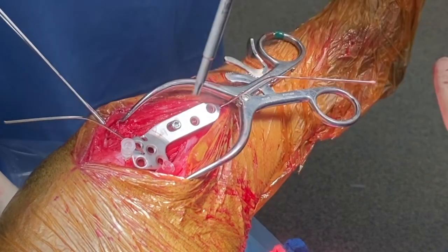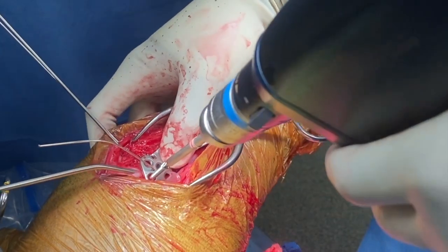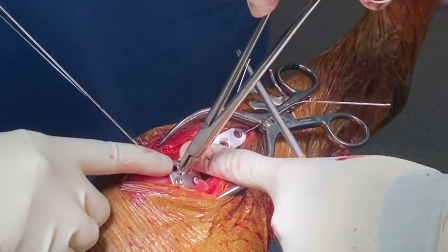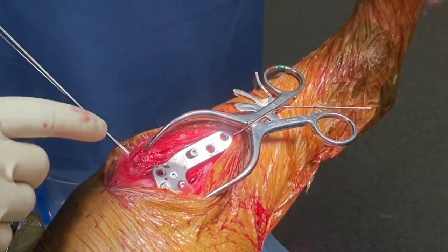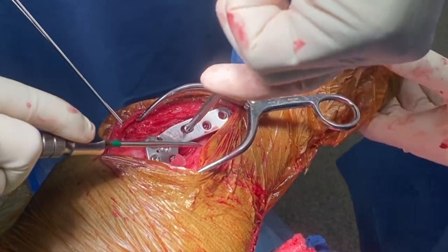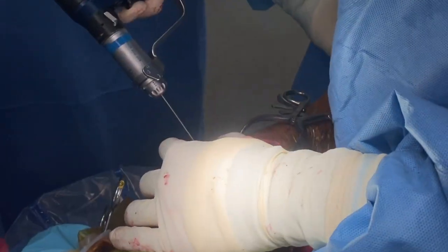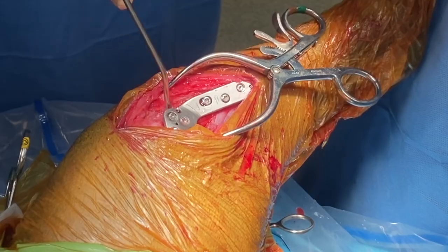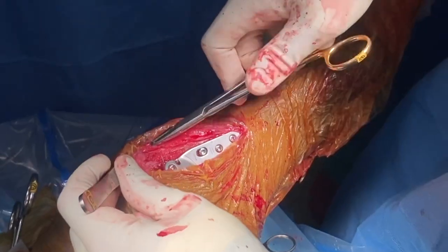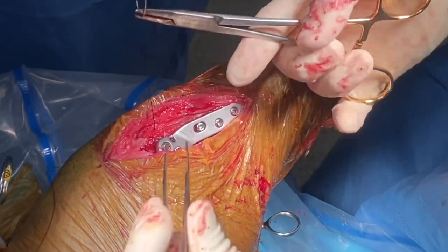Here a cortical screw is being placed in the load position to generate osteotomy compression. Locking screws are used in the plateau segment. K-wires are removed when at least one to two screws are placed. The cortical screw is tightened. The anti-rotation pin is removed and the remaining screws are placed.